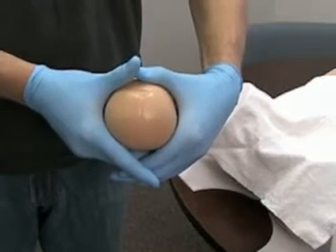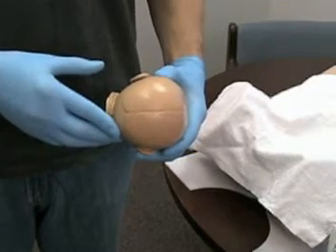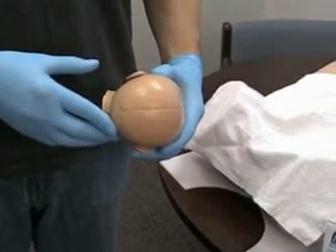I'll now have my assistant place the silicone fetal head in the birth simulation model, and then we'll proceed with the steps toward delivery.